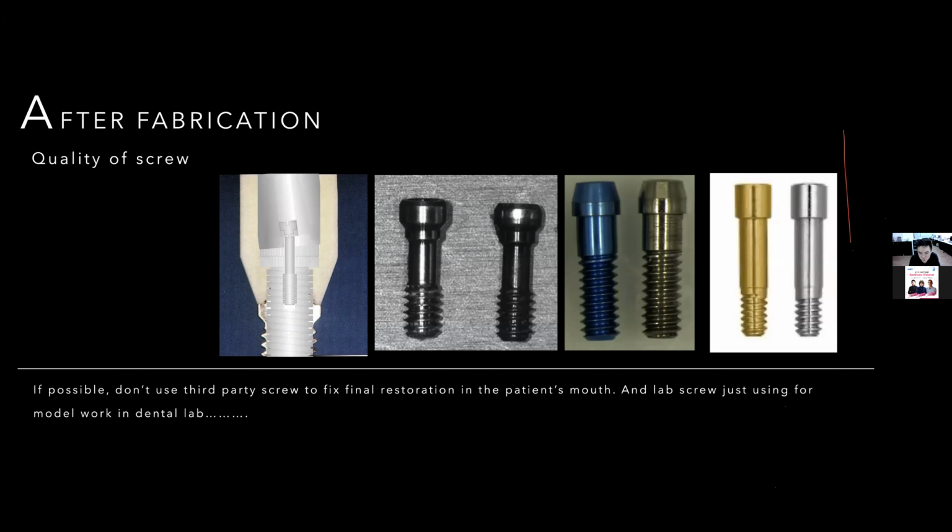So if you use this screw, maybe you will have a problem and the lead will break or easily loosen in the patient's mouth. You can see they look very similar, but the surface, the precision, the quality and the smoothness are totally different from the final screw.